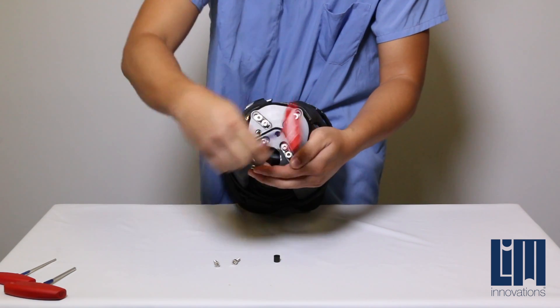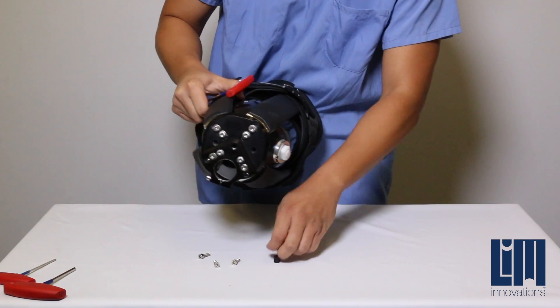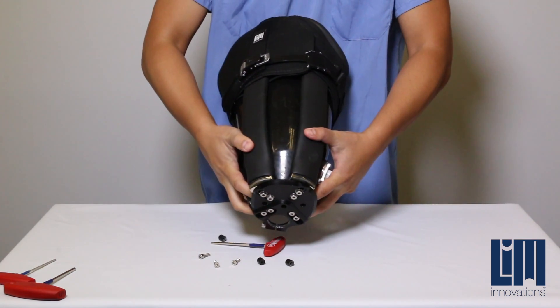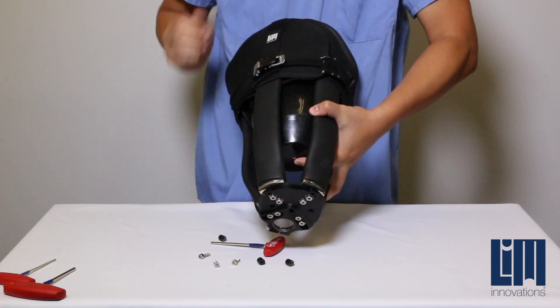Once all three screws have been removed, gently place your fingers in between the base plate and the distal end of the cup and lift up. This will separate the fill cup from the infinite socket.